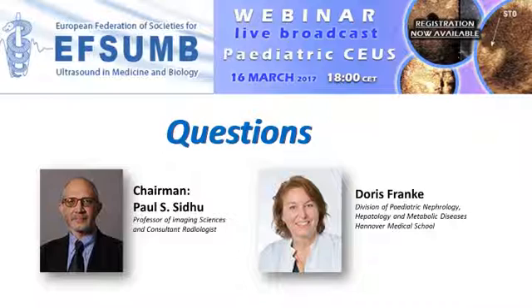Yes, you have to know your ultrasound system. The ultrasound system, and even which generation of ultrasound system you have, require quite a different dose. Then it's highly dependent on which probe you are using. The higher the frequency, the higher the dose. Then it is important which mode you are using. There are different modes of contrast-enhanced ultrasonography you can use, and they need a different dosage.